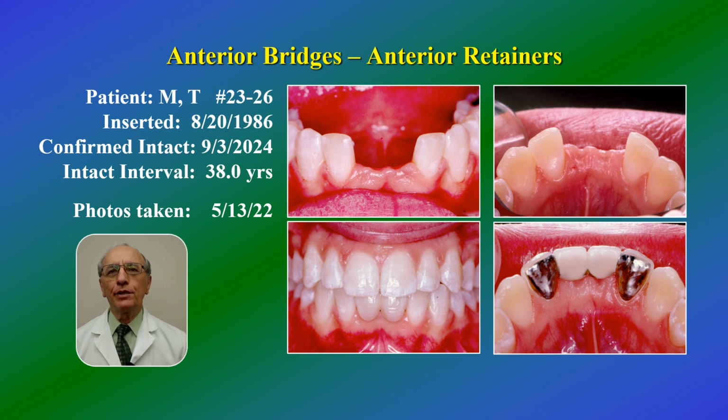Mandibular Maryland bridges are especially advantageous, avoiding potential pulpal involvement and fractures due to the narrow dimension of the incisors. Incisal graying is prevented with gold plating and opaquing bonding resins. Note the long-term continued success of 38 years.